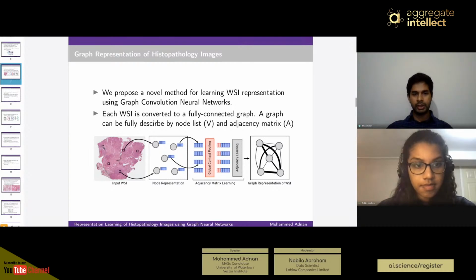So we need to condition the relation between each patch on the information present in the whole WSI, right? So that's why we extract a global context vector, which aggregates all the information present in the WSI and condition the vectors on it. So the matrix I get here could be different for different patches depending on different WSI.